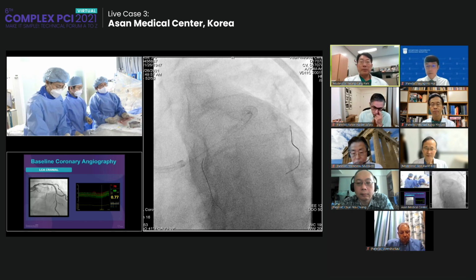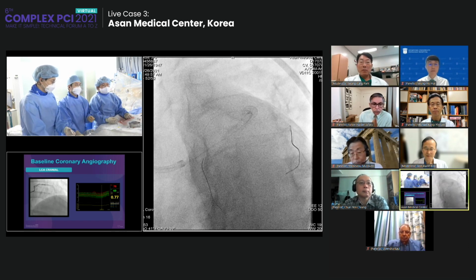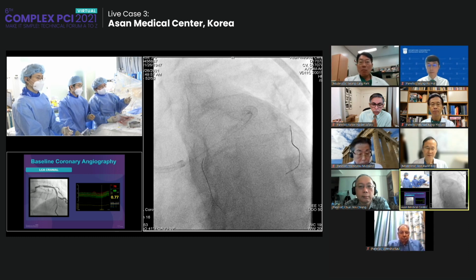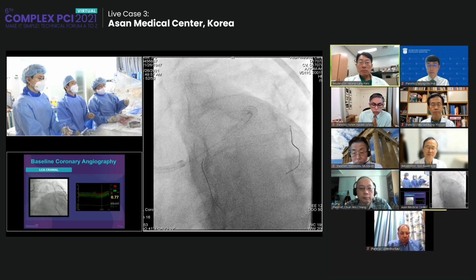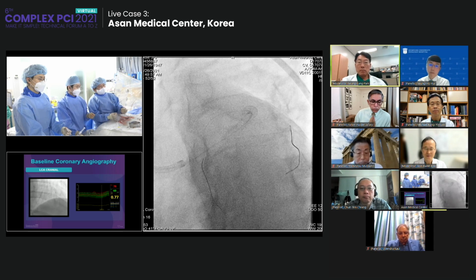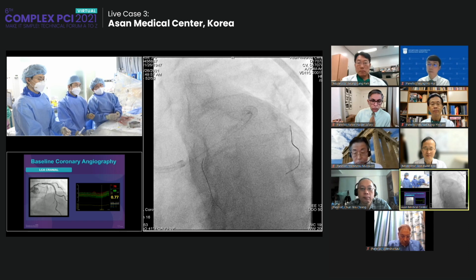Background: extensive ST depression is a very rare case. I assume that a very tight stenosis at the proximal portion of the coronary artery can make the treadmill test stage 2 strongly positive. The pressure wire pullback FFR shows that the proximal lesion is functionally more significant, and the treadmill test shows stage 2 positive. So these two findings consistently show that the proximal LAD lesion would be the culprit for the patient's symptoms.